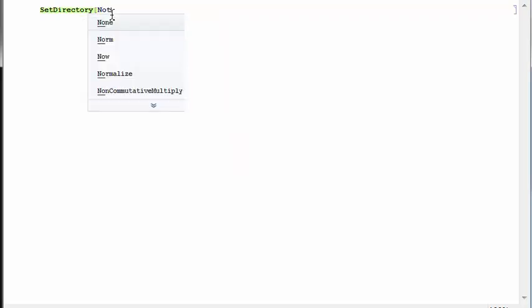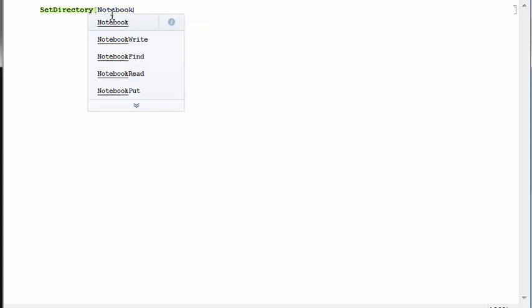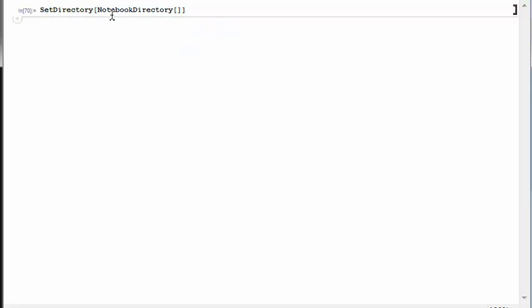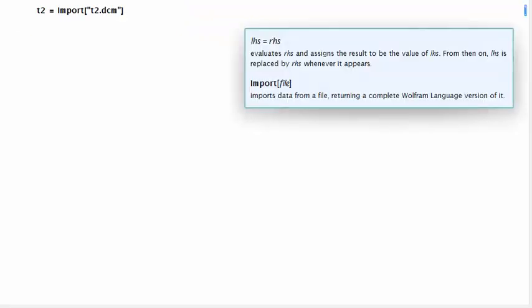Afterwards we use the command setDirectory notebookDirectory to make the files accessible without specifying the full paths. We load the brain MRI T2 volume that's in a DICOM file by calling the command import on the string t2.dcm.